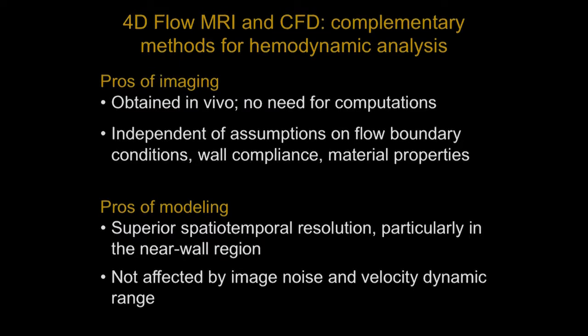So when we want to combine modeling data or knowledge about the fluid flow with 4D flow MRI measurements, it is challenging because we don't have a gold standard. And therefore, it's difficult to assess the error of our techniques. But what we do know is that the source of error is different for each technique. And we also know that basically these two or other modalities are representing the same underlying flow.